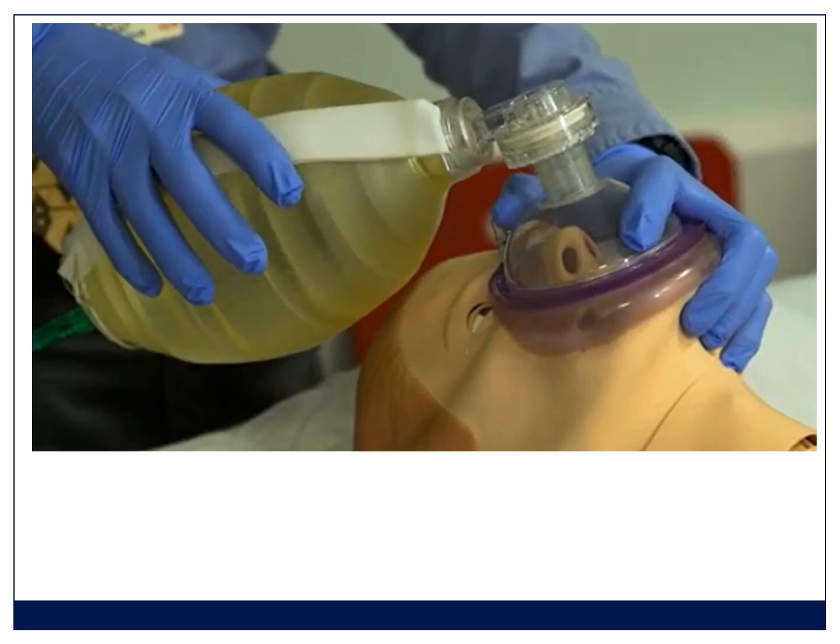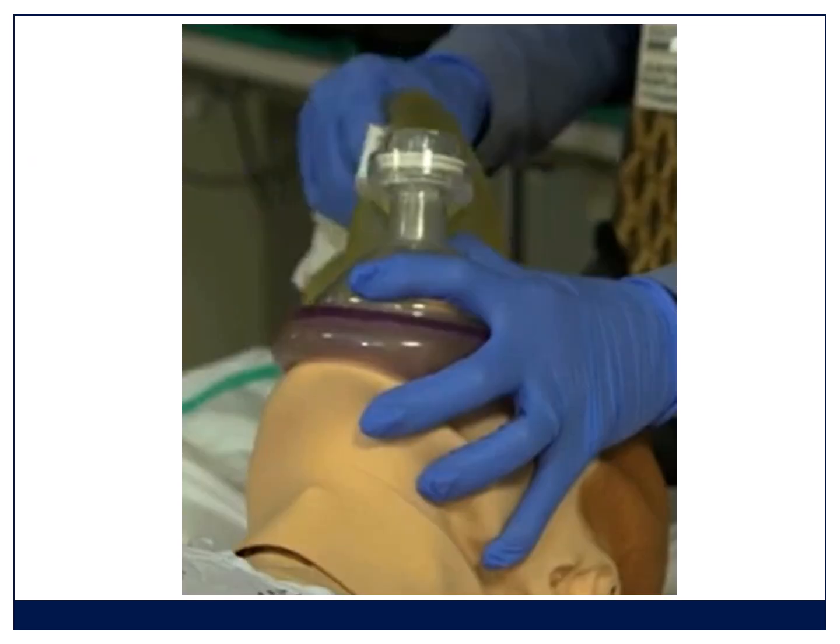And if you can't intubate or insert a supraglottic airway device, this technique can get you through a general anesthetic. So it's really important. Now, this is the grip that you find is most commonly taught. So looking from the side, you've got the mask between your thumb and your index finger, and the other 3 fingers are underneath the jaw. And remember that you're not pushing the mask down, you're lifting the jaw up. That jaw has got to come up. And the little finger in this technique is hooked around the angle of the jaw, and that's what you're actually using to try and lift the jaw up.